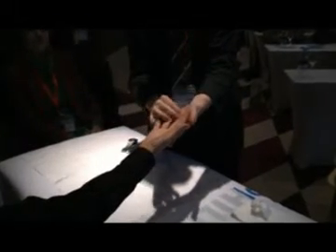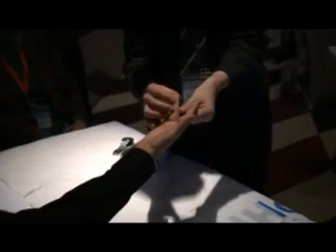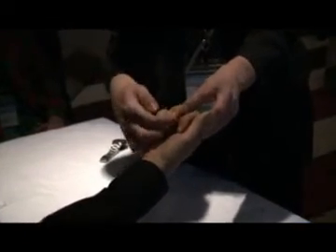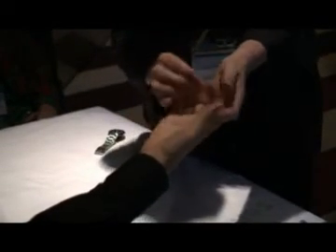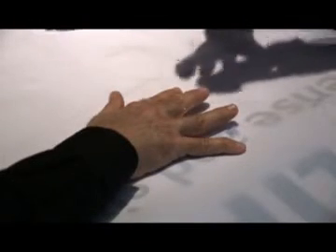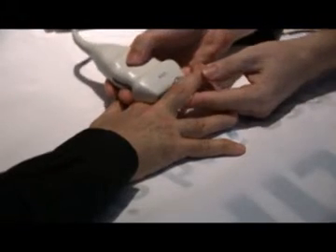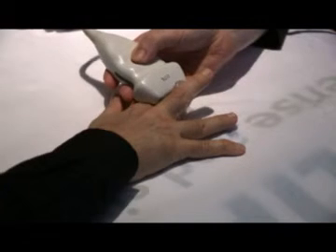You know, it's sort of a little bit trigger finger, not very much, but he has difficulties here in these two joints, and it doesn't just make a fist. It comes a little bit up if you compare it to the other fingers. Osteopenia close to the joints, but no erosions. And lateral areas, that means you really have to look around the joint all the way through. You see there is something.